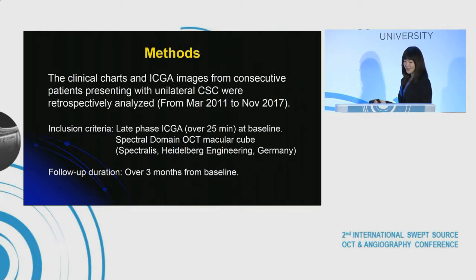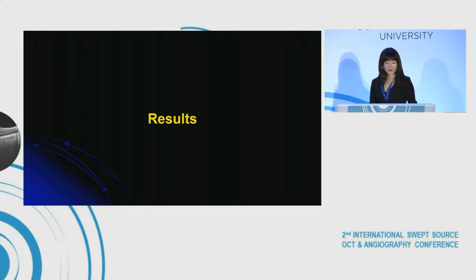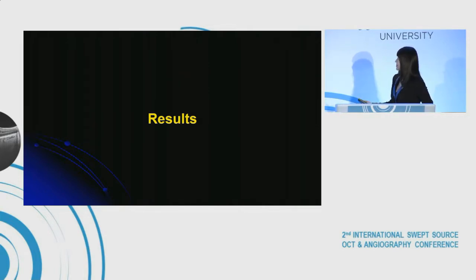Unilateral CSC patients who were followed up for more than 3 months were retrospectively reviewed. We included the images of late phase ICGA at baseline. Now, let me show you our results.